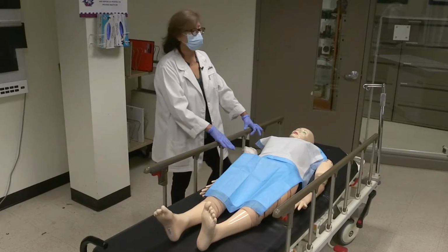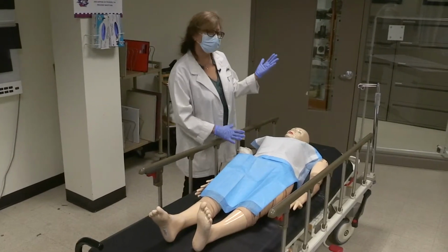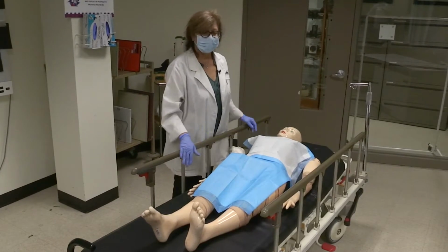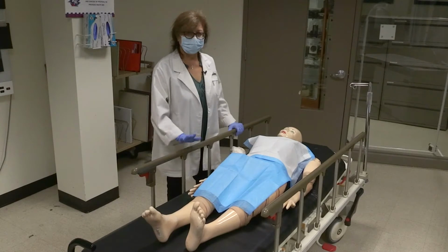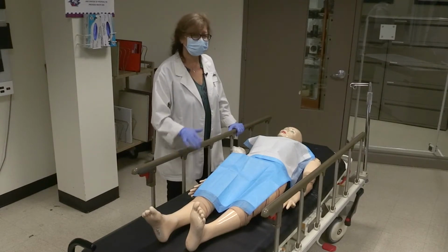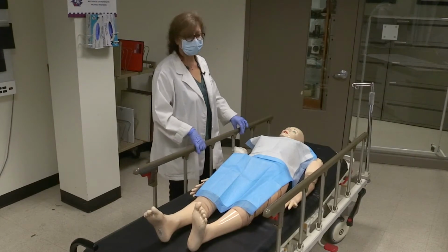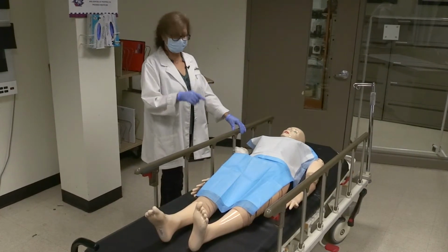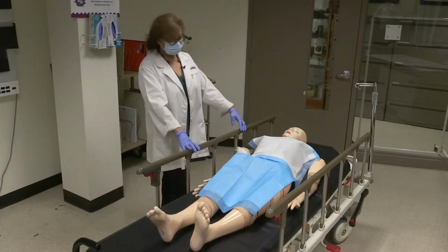Obviously, you're going to leave your patient in a comfortable position, whether it's lying flat or sitting up a little bit, covered, and with the side rails up. If you're walking away from a patient that's on a stretcher, that's what you have to do. Brakes are on, side rails are up, the patient is comfortable, and the stretcher is at its lowest level.